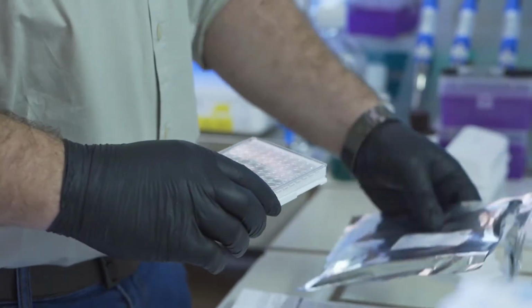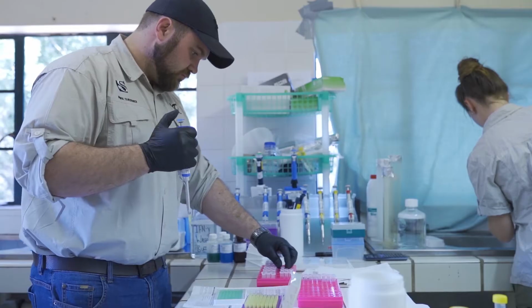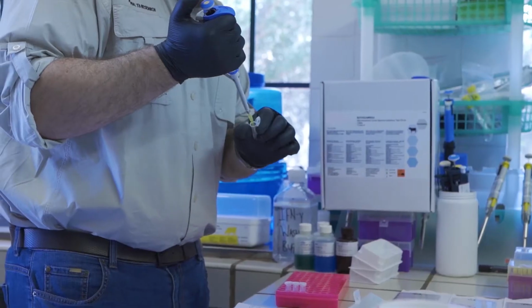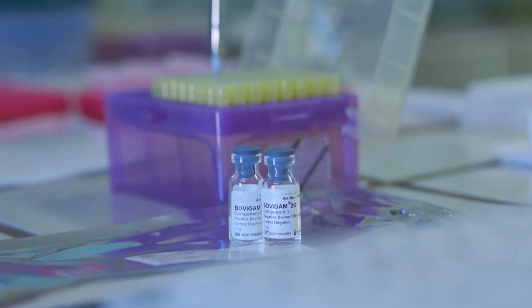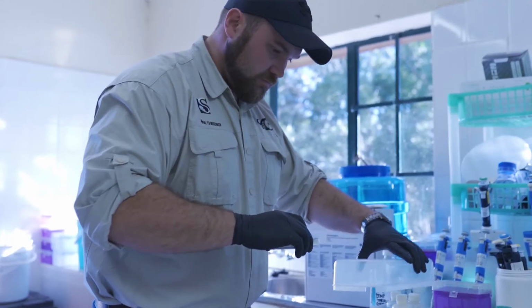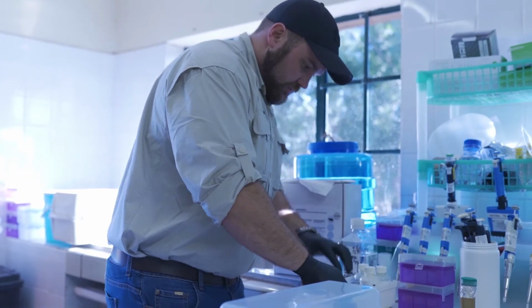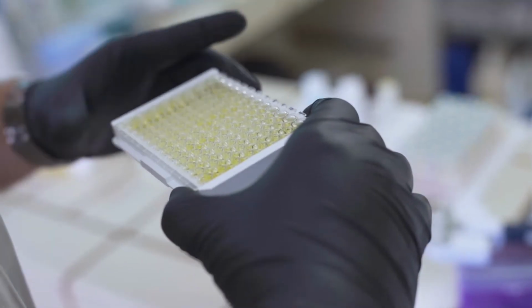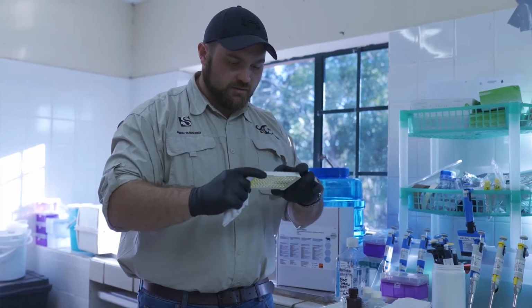The advantages of using the BOVIGAM test in buffaloes is, first of all, it's commercially available, so we believe in the quality of the product of the kit. It's easy to use, especially in a field situation, and is robust, and therefore we can easily take the blood samples with a minimum of equipment, set that up. It's really important when we're working with wildlife that we use blood-based tests because it only requires a single immobilization instead of the skin test that requires 2 immobilizations.